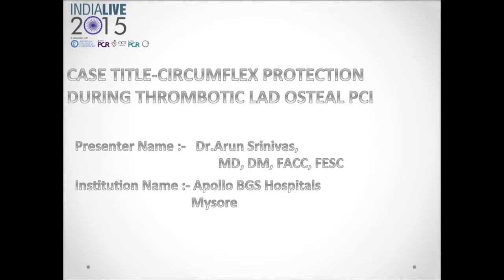I'll be speaking on osteal-LAD thrombotic lesion angioplasty and the problems that we encounter with it. We'll start with a case presentation.